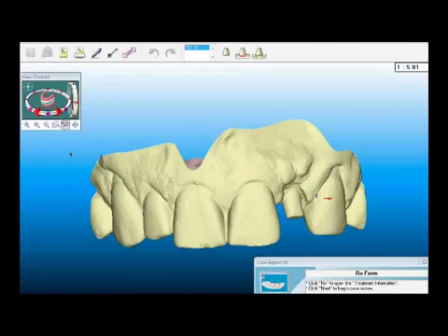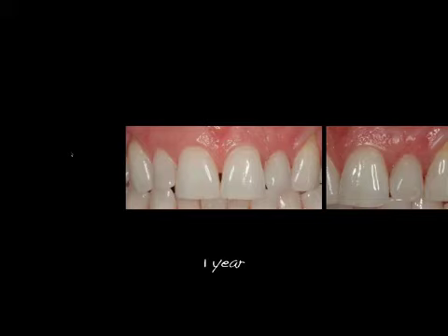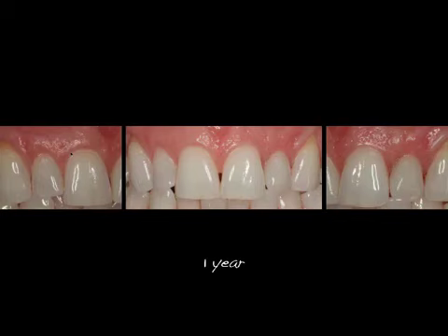The iTero scan for that crown, I did not do any tissue conditioning. At 3 months, we simply scanned, we exposed a little bit of the abutment, and we scanned it. Our lab created a beautiful Emax crown, and this is the follow-up at 1 year. We still see perhaps a little bit of that scarring from the flap design. However, we have very, very nice and healthy soft tissue. We can see the quality of the papilla that we got proximally, and this is again without any intervention.